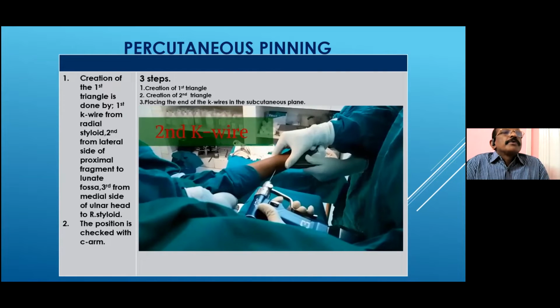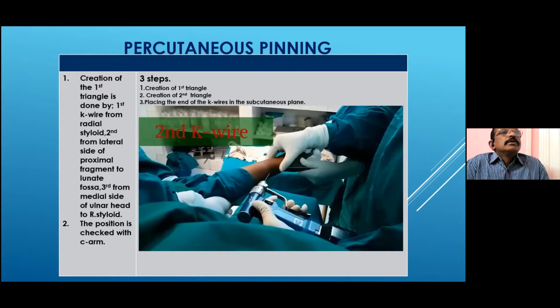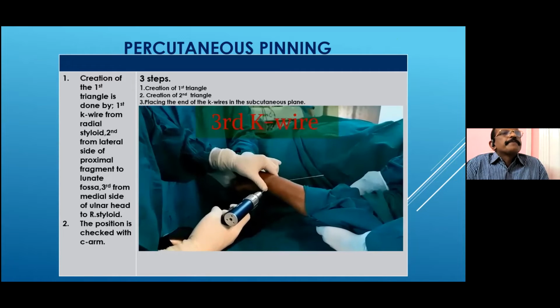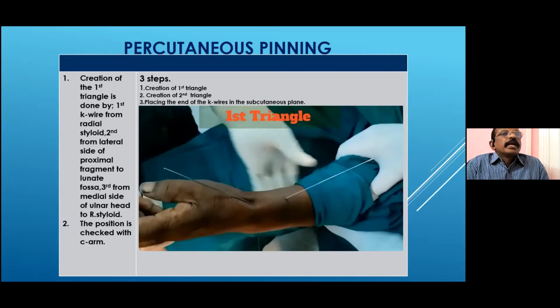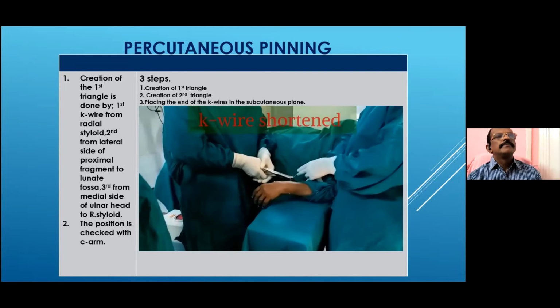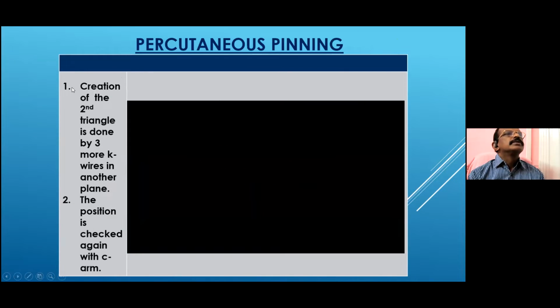The second wire goes from the proximal fragment towards the lunate fossa, also at the same angle. And the third wire from the ulnar head towards the radial styloid through the radioulnar joint. You can see the orientation of the wires so that the first triangle is completed. The position is checked with the C-arm, and the length of the wires is cut short so that we can create the second triangle.